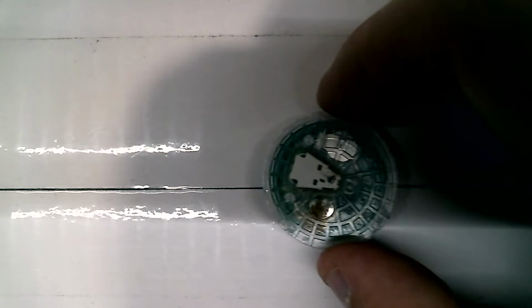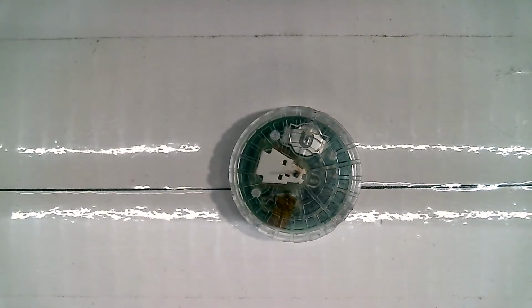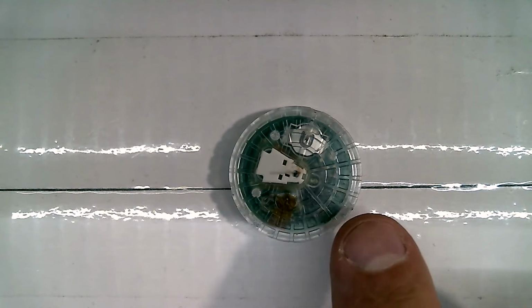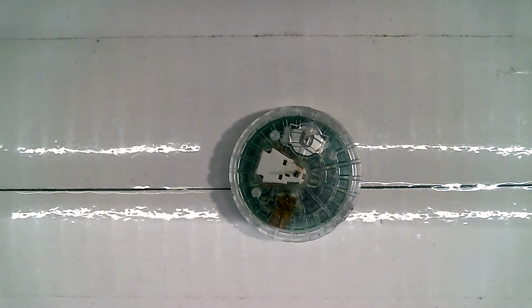So how does it do it? Well, that's a good question. Let's get it back in the center of the frame. See if we can see what's in here, and then we'll take it apart. So you can see the part in the middle here is actually the part that does the sensing. We can also see, looks like there's a battery in there, but besides that we can't really see. I don't know if I can get any closer to show this. Probably not. It's probably not going to focus any closer than that.